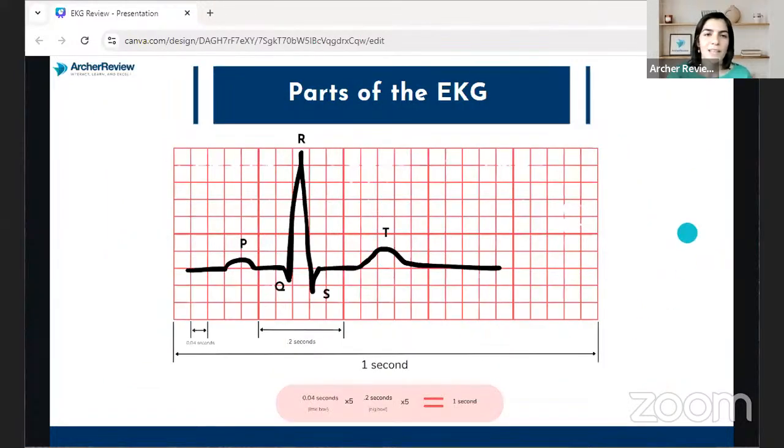So let's look at it another way. Let's look at it on that EKG strip, which is usually printed on this beautiful graph paper. If you are as old as I am, you went to school with actual graph paper where you had to do math on it; that's what this is printed on. Those little boxes actually mean something. That tiny little box is about 0.04 seconds. If you count it out, you see that there are 5 of those tiny little boxes within these bigger, thicker boxes. So 0.04 times 5 is 0.2, so that's about 0.2 seconds long.